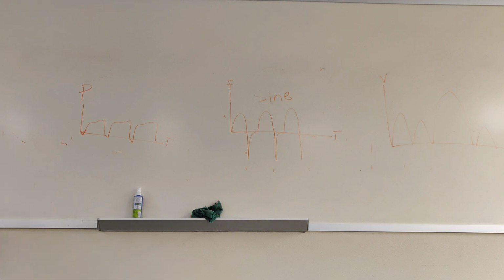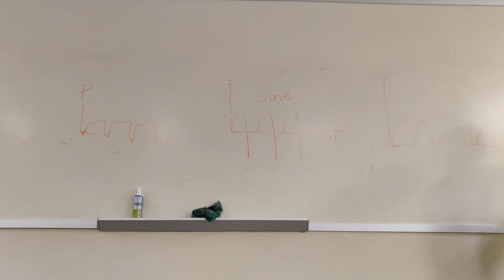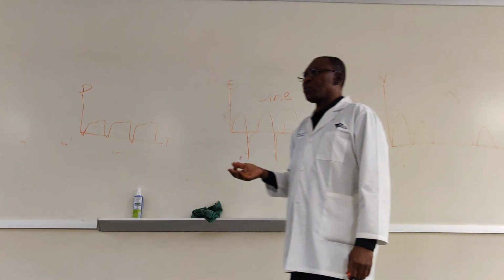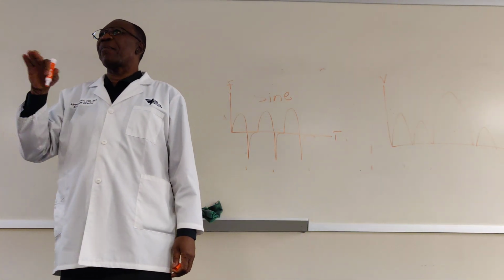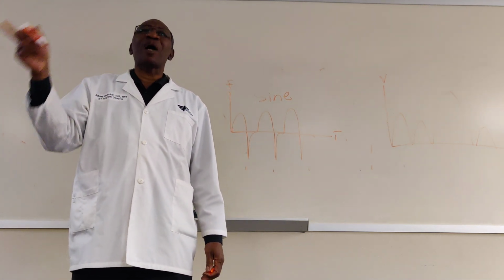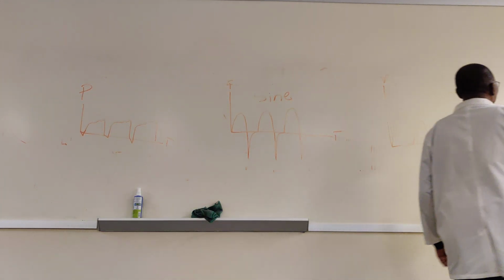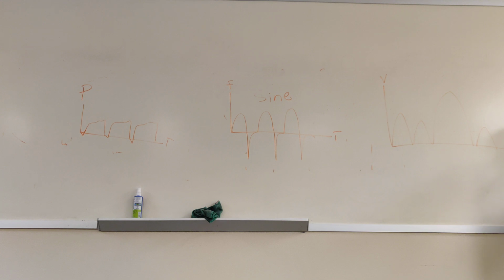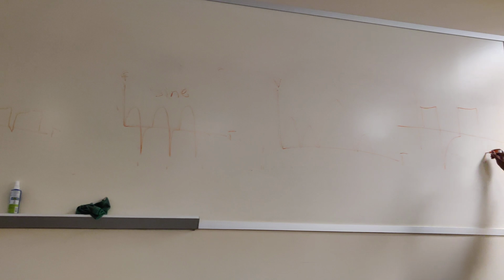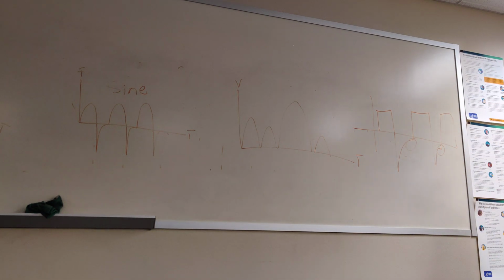And then I showed you the air trapping. You have to know that one. So another question is, if a respiratory therapist wants to find out whether a patient is air trapping on the ventilator, you look at your flow time curve. Remember that. Flow time curve is what you look at, because basically what it means is that if your expiratory flow is not returning to baseline before the next inspiration, then you have air trapping.